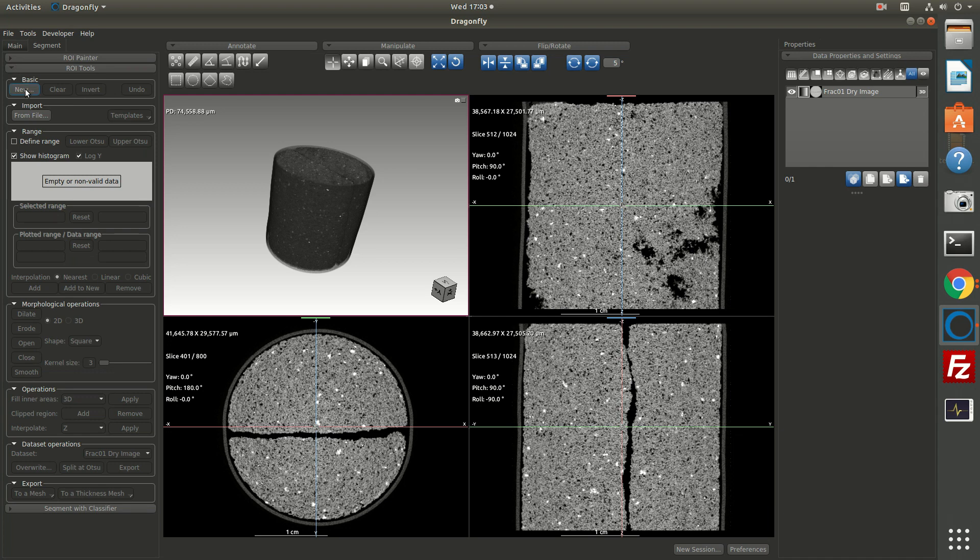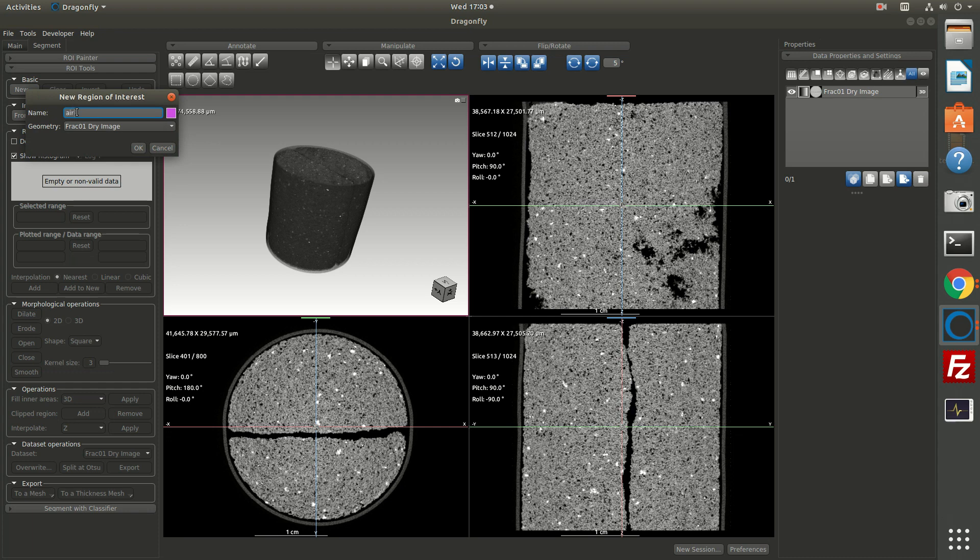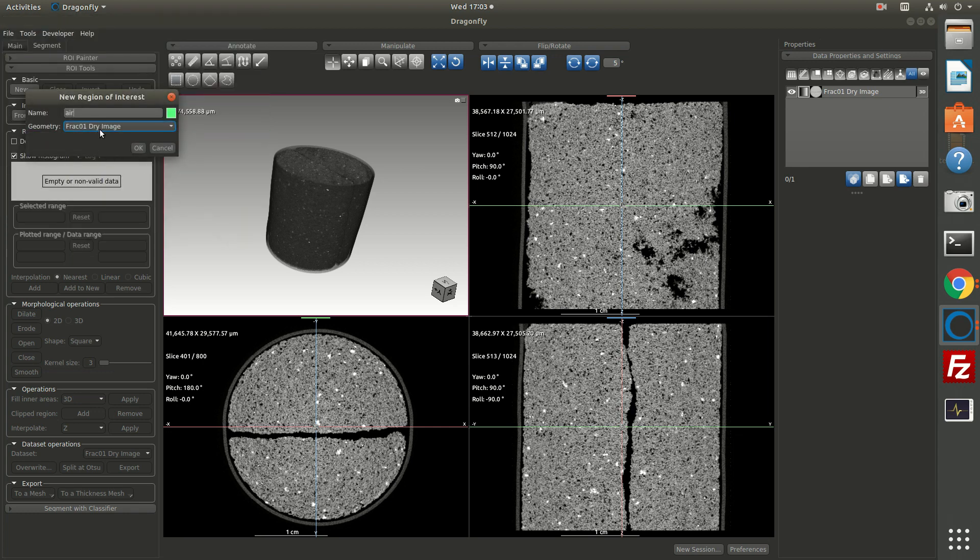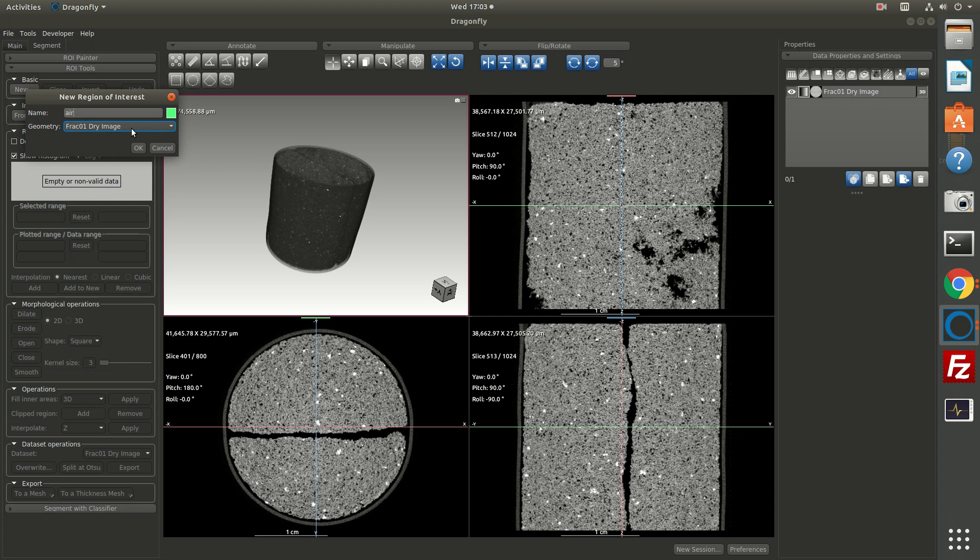So we could, for example, create a region of interest, and we could call it air. So I create a region, I give it a name, I give it a color—I'm going to give it a bright green color—and then you give it a geometry. That's the canvas that you're painting on. That is, your pixels that you paint have to match up with some other data set in your workspace. And so that's what the geometry here means.